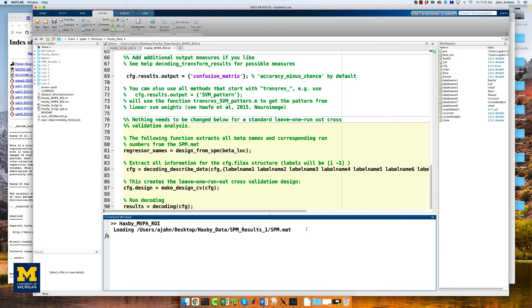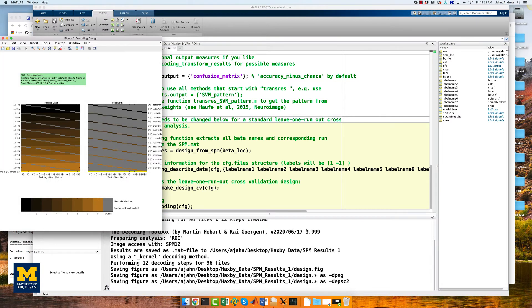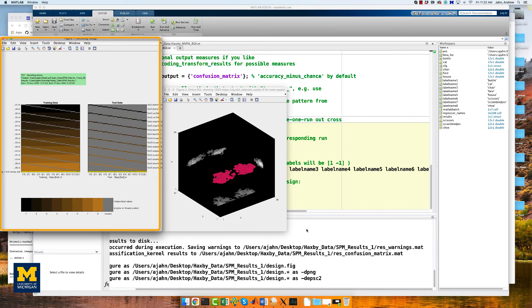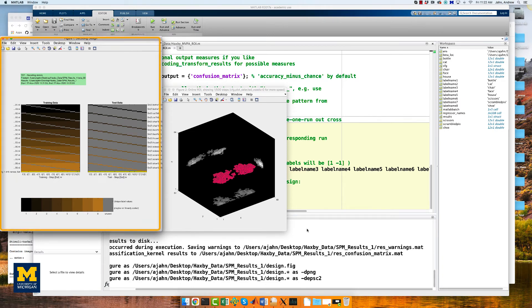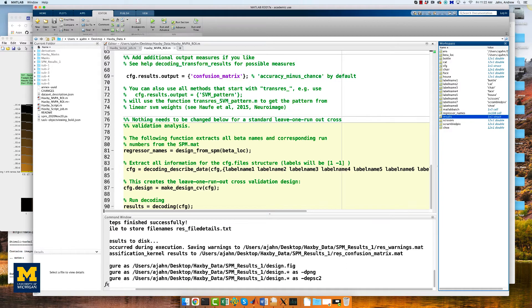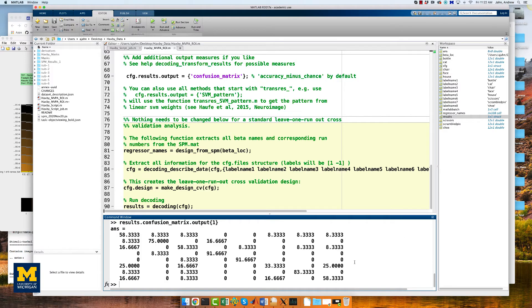Save the file and run it from the terminal by typing Haxby_MVPA_ROI. This should only take a few moments, and you will see the following figures: on the left, the beta maps used as both training and testing data using a leave-one-out cross-validation procedure; and on the right, a three-dimensional representation of the voxels in the mask. The results are stored in a variable called results. To see the confusion matrix, type results.confusionmatrix.output{1}. It should return something like this.